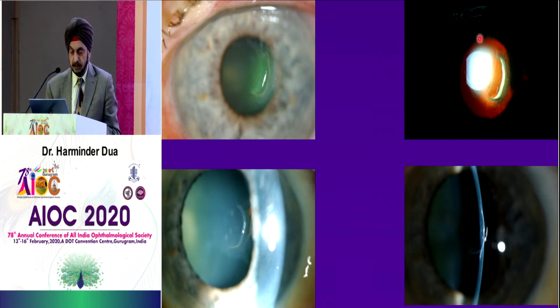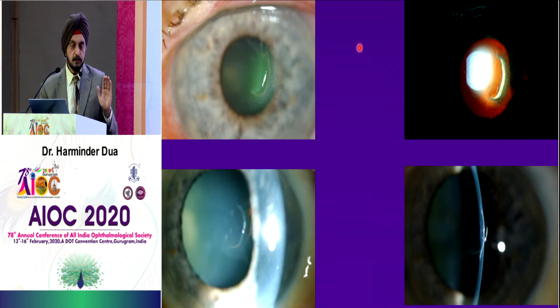You see this very nicely in retroillumination, this hinge. So when you see a wound like this, do nothing. Just give antibiotic drops. The endothelial pump will cause the edema to settle and everything will fall back into place. You don't have to give tight sutures to try and squeeze it back into place. So if it is a non-penetrating laceration like this, let it be and it will settle. As you can see, everything goes back into place quite nicely.